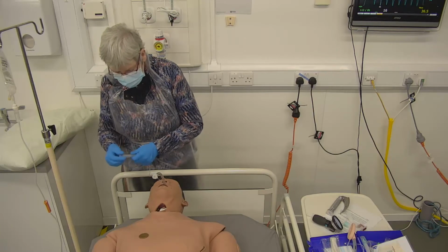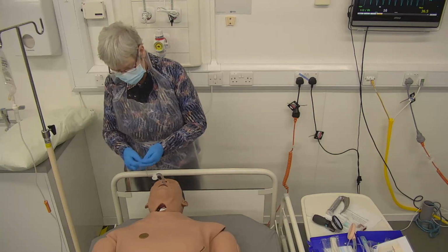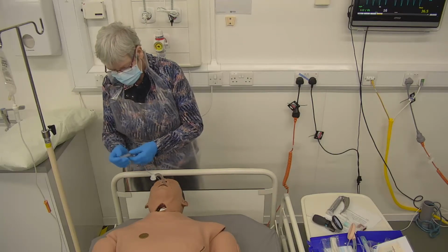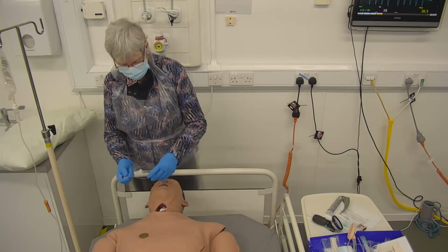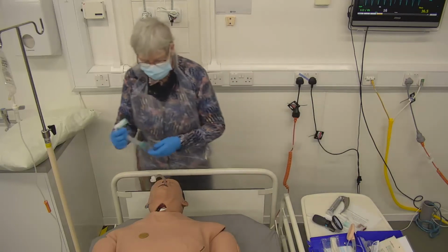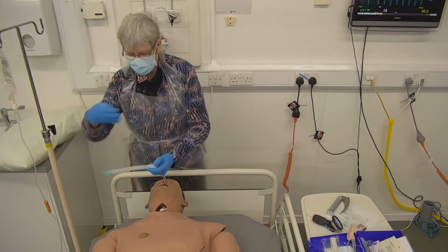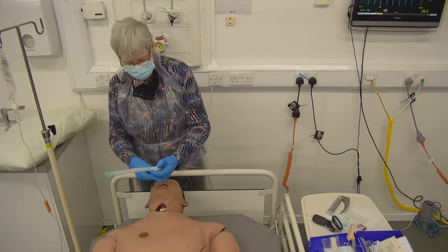fixing it within the trachea. So it's gone through the larynx and into the main airway, the trachea, and it's secured there because I have now inflated the balloon. That is now relatively secure. This would then be attached to a ventilator through a connection tubing. That would go to the ventilator, and air would then be pushed into the lungs through this tubing.